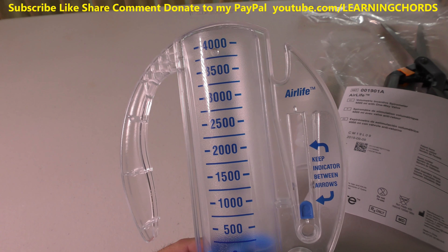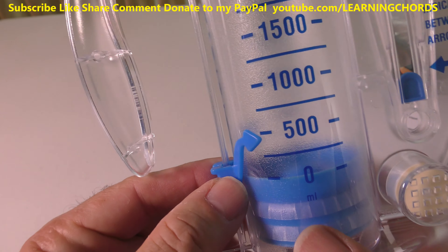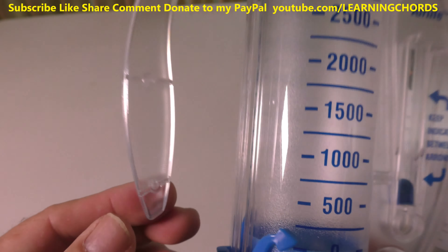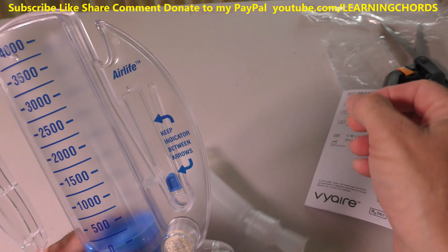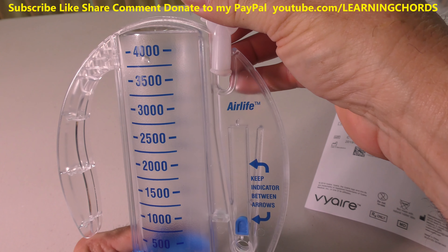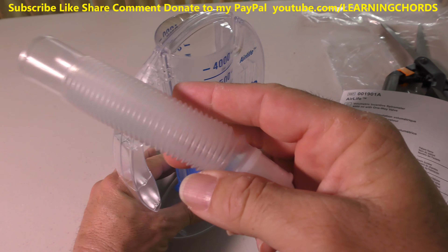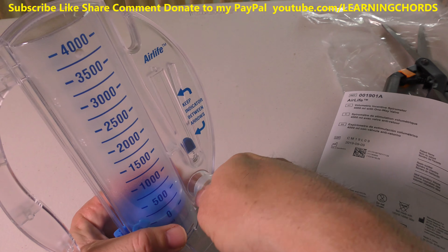This has got really big writing, which is good for me. It's got an adjustable piece here so that you can set it where you need it. It's got a handle. There's a little piece on top — I think it's supposed to hold the mouthpiece. On the front we have this expandable tube — you stretch it out and it slides on to the front fitting easily.